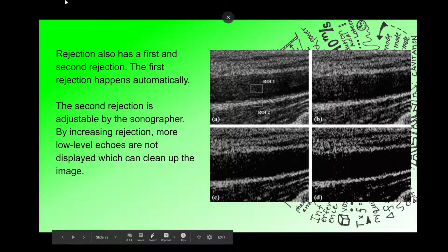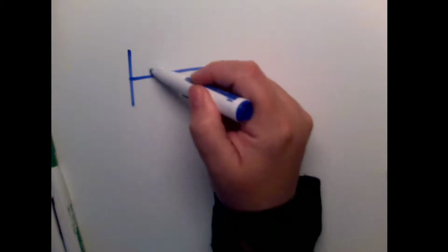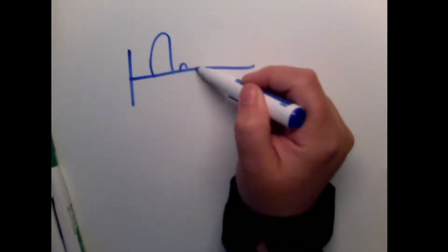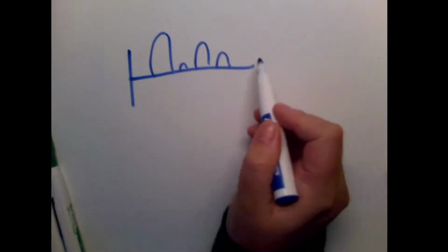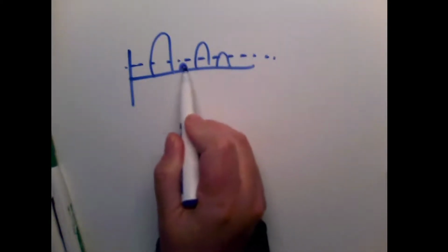So we'll go back to the whiteboard here. So remember, demodulation occurred, and let's say we had some really big echoes, we had a tiny one, kind of a medium one, maybe this one. And so the machine already went through and got rid of all the tiny ones. As a sonographer, maybe our rejection is set here. And so now this little information here, no longer even going to be displayed. The machine, you are rejecting it. You don't want that information.